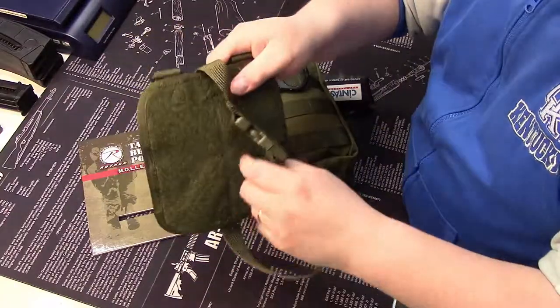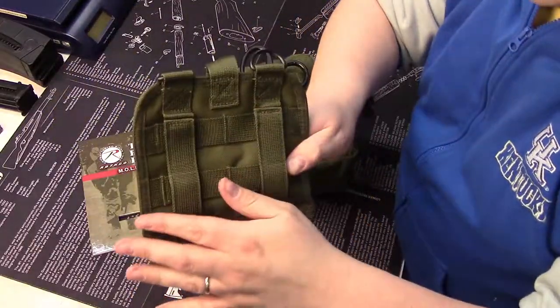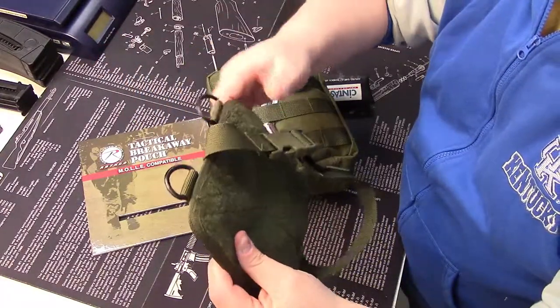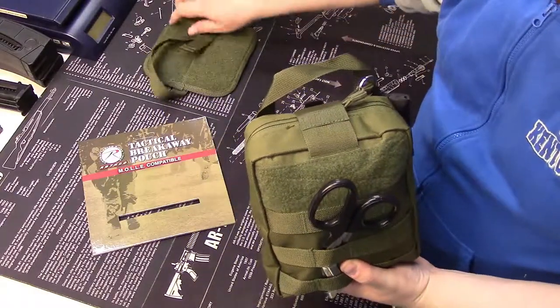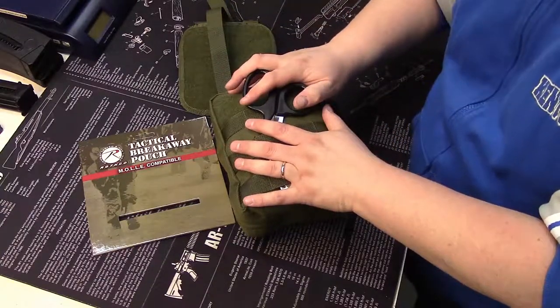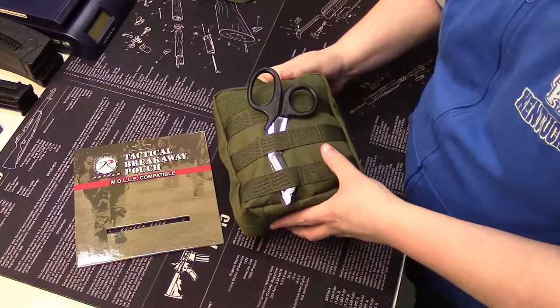One thing I wanted to note before we show you how I packed the bag is that the back panel has a strap, a MOLLE attachment, and D-rings. So if you wanted to, you could attach paracord or a luggage strap or a sling of some kind and carry it around as an independent medic kit. But since I'm going to keep this in a backpack and I don't want to advertise that I have a trauma kit, the back panel is going into storage.